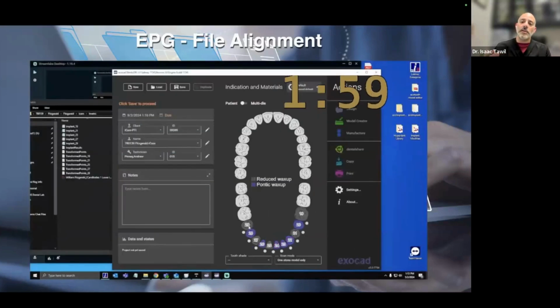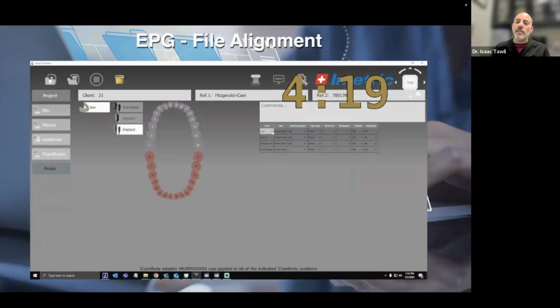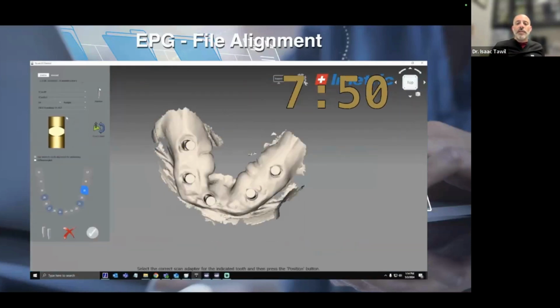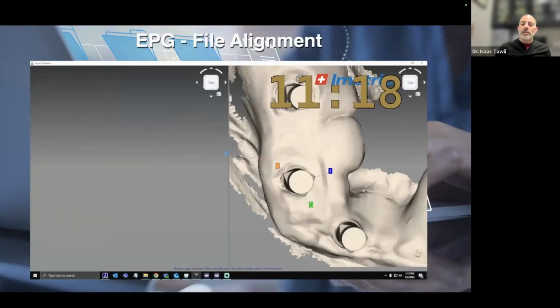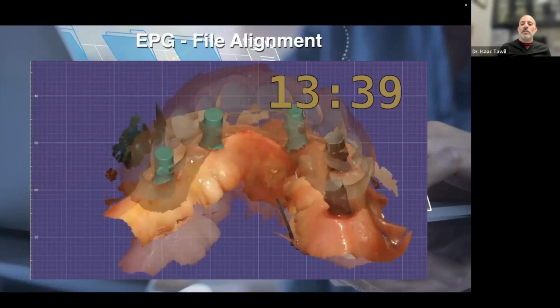And I do have to speed it up because we don't have that much time, but you'll see the process that goes on in this case. And this is one of my favorite photogrammetry units, the iCam. It's a wonderful device, works very well. It's a bit pricey, but it works very, very well. And we're doing the data alignment so we can match the intraoral scan with the scan bodies or healing caps if you'd like. And we can match those two tissues, and then we finally bring it into the software.